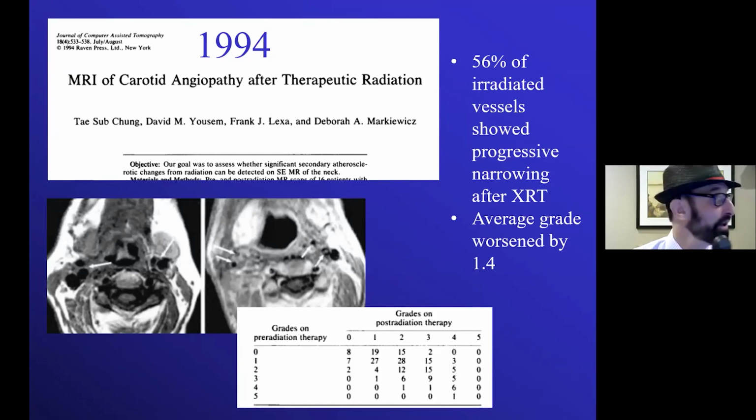And this was actually taught to me by my good friend Tae-Sub Chung from South Korea, who was visiting us at the University of Pennsylvania and asked to do a project on looking at the degree of vascular narrowing on pre-radiation and post-radiation carotid arteries to see whether there was a manifestation from the radiation therapy.